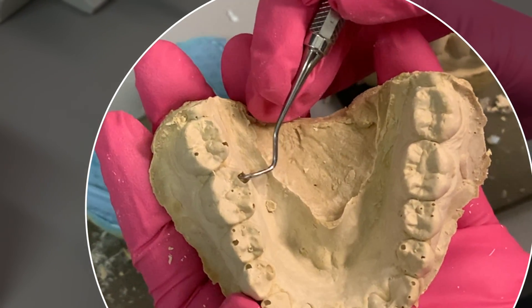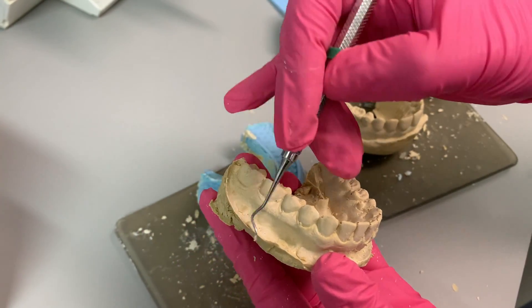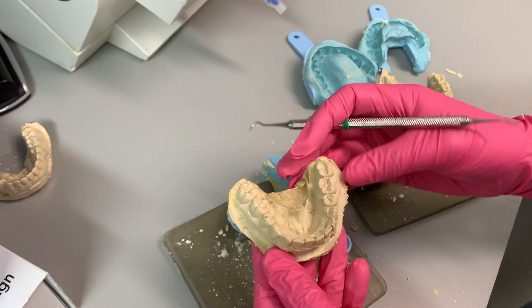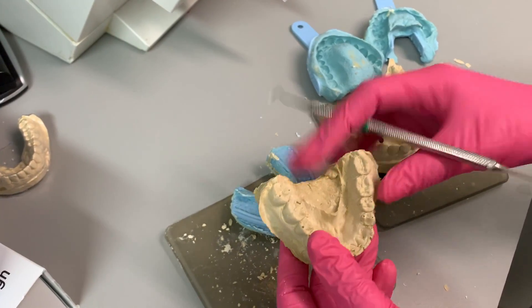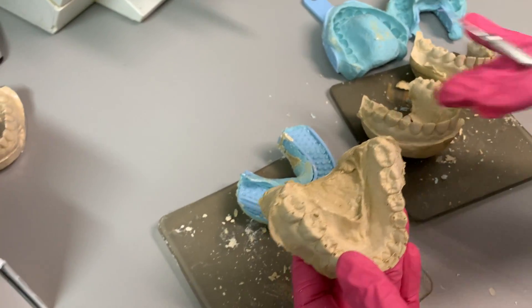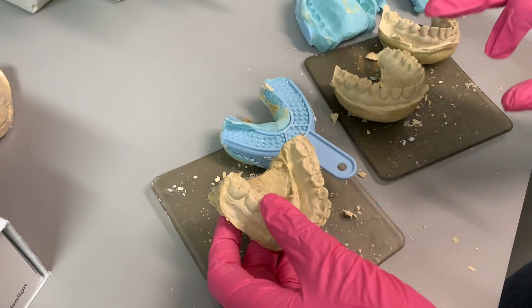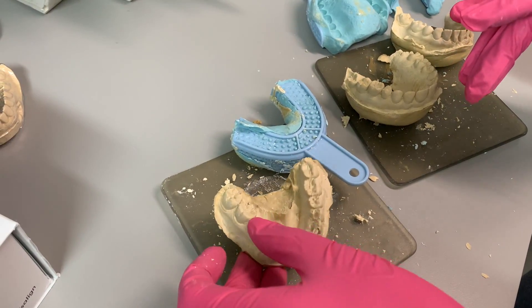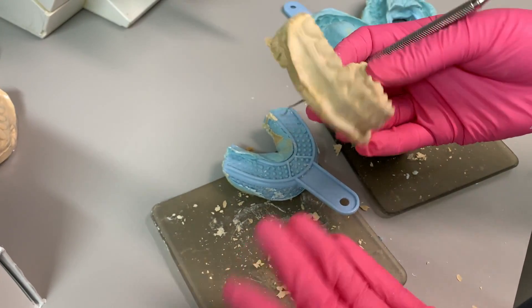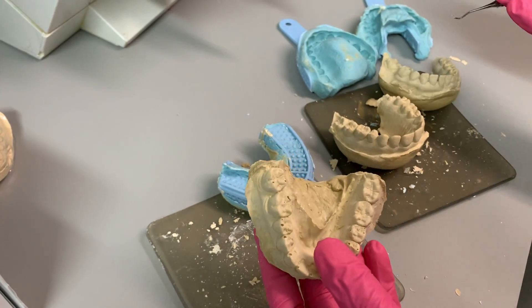You see how nothing here is going to get stuck and be in the way of the bleaching tray. Even though it looks kind of messy, it's not a pretty model, but we don't have to present this to a patient — it just has to be functional. That way you're not going to get stuck anywhere and you don't have to trim. All you have to do is be mindful that you don't need all this extra stone everywhere, so then you don't have to trim.